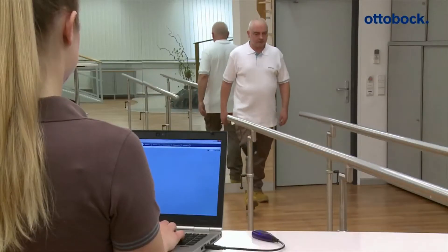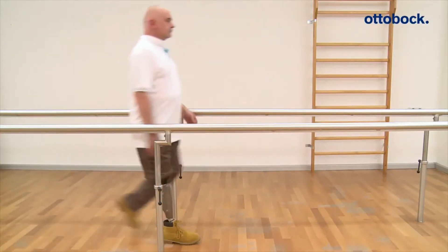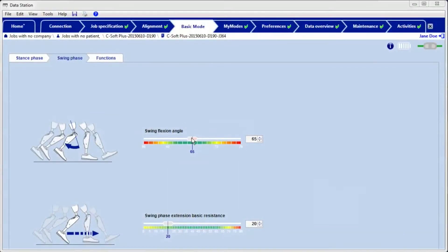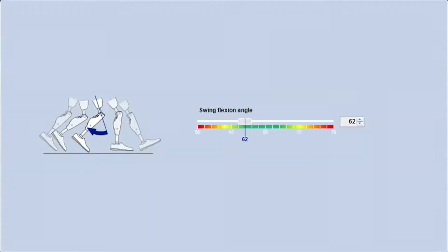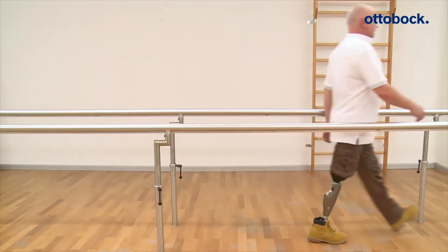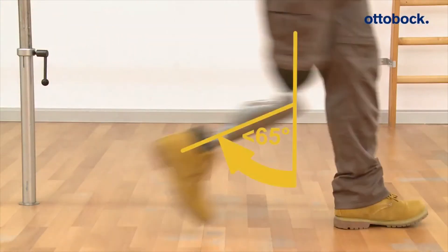While walking on level ground, this value is checked by looking at how far the prosthesis swings backwards. If the value is significantly set too low for the patient, the prosthetic leg comes forward too fast into knee extension. In addition, the ground clearance can be reduced during swing phase, which could lead to a higher risk of stumbling.